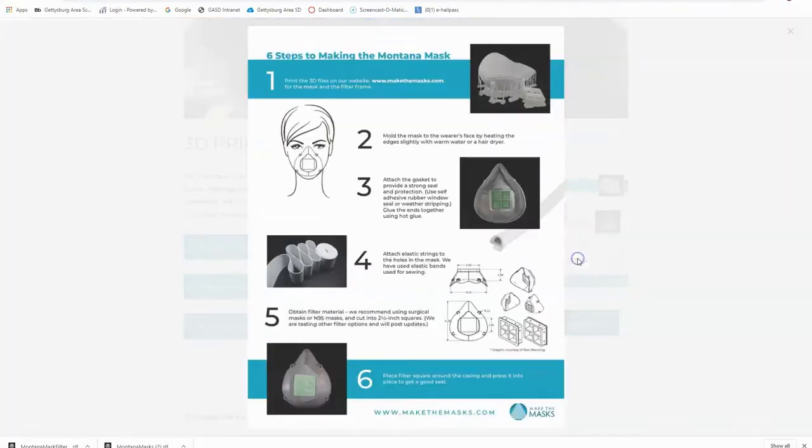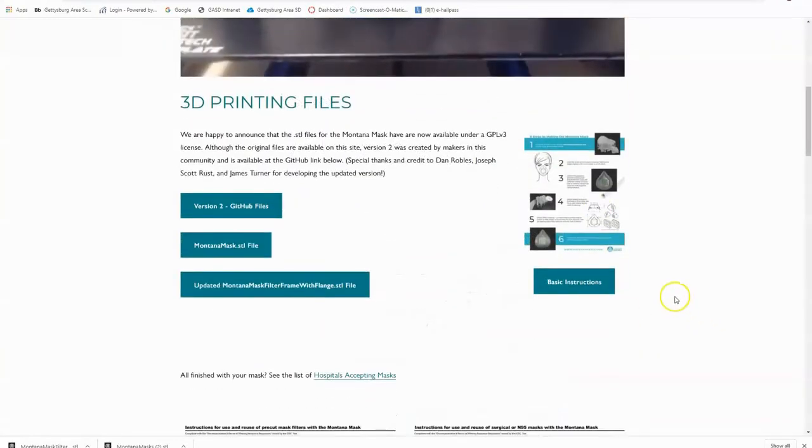Now, here's also the basic instruction sheet on the construction process. There are more detailed instructions on assembly and fitting. This is just a quick overview, so I would also recommend taking a look at that. So now the STL files have been downloaded, and we're ready to jump into Repetier-Host.